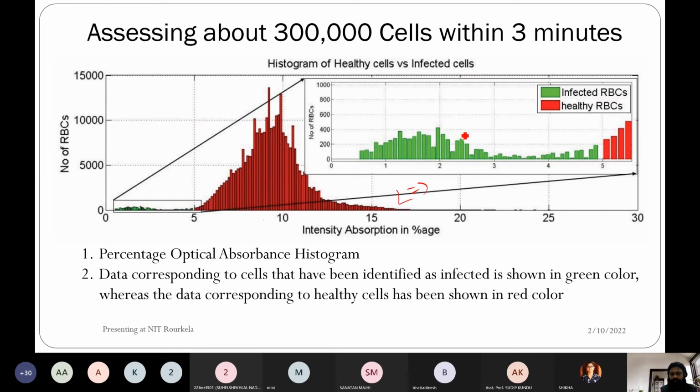And we found that this sample was at a slightly higher, next stage, not an early stage. With respect to that, when you have the early stage, we used to get absorption changes at this place. But when we have late stage information, we found that the absorption is very poor in this case.